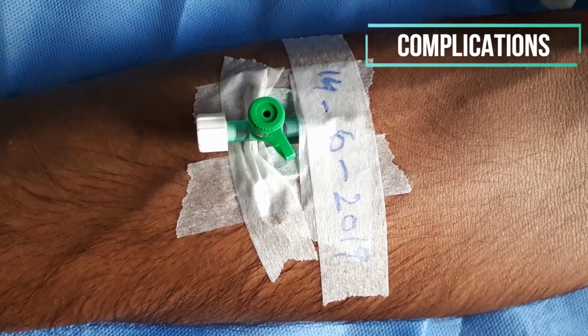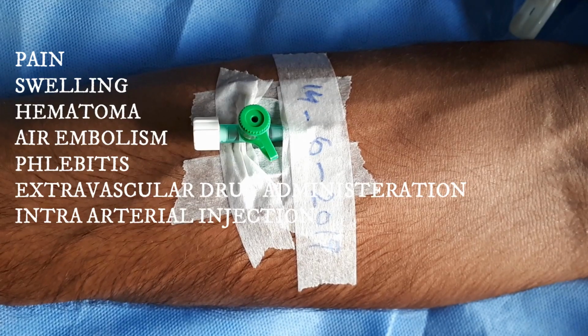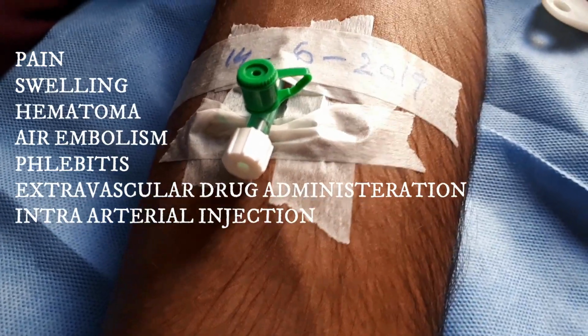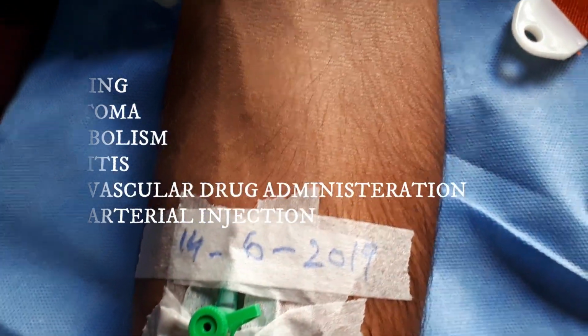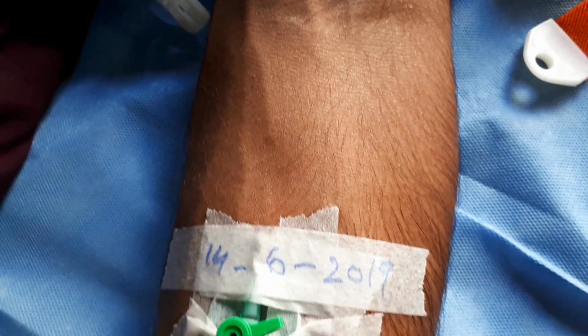The possible complications of an IV include pain, swelling, hematoma, air embolism, phlebitis, extravascular drug administration, and intra-arterial injection. With this, the procedure now comes to an end.